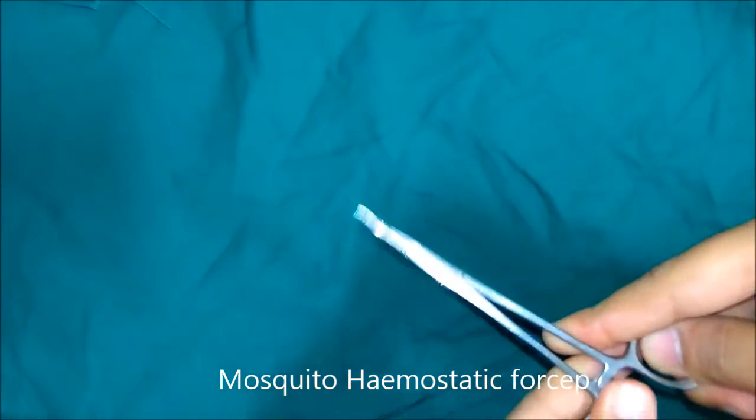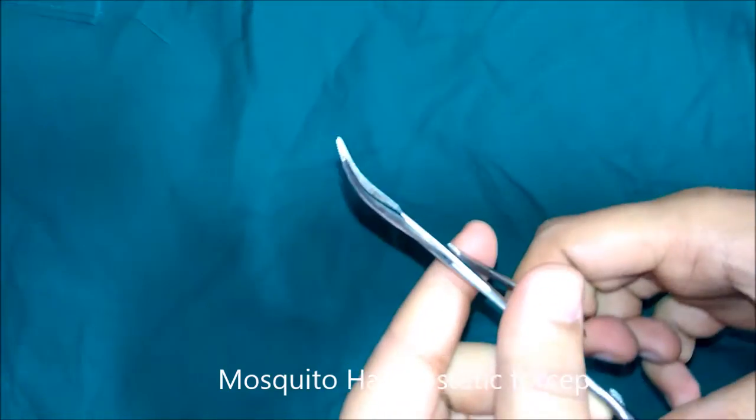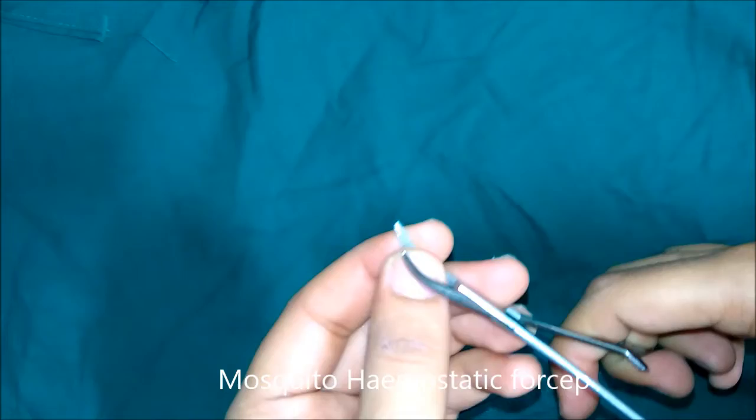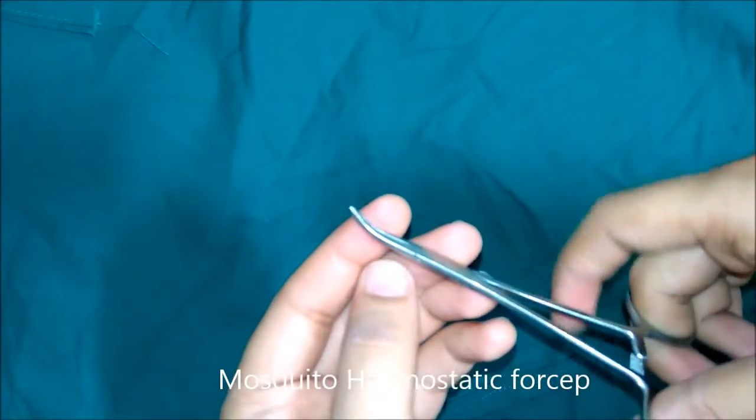This is mosquito haemostatic forceps. This is used to hold fine bleeding vessels during operations like cleft lip repair or circumcision. It is usually used for operations in infants and children where the vessels are delicate.